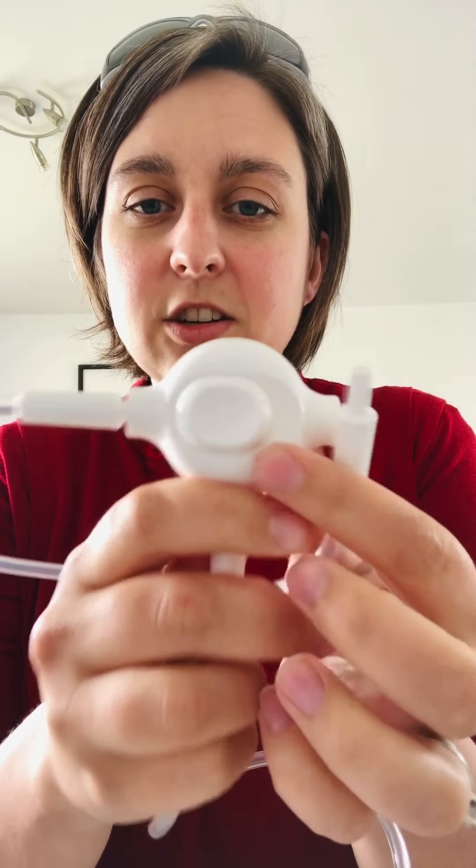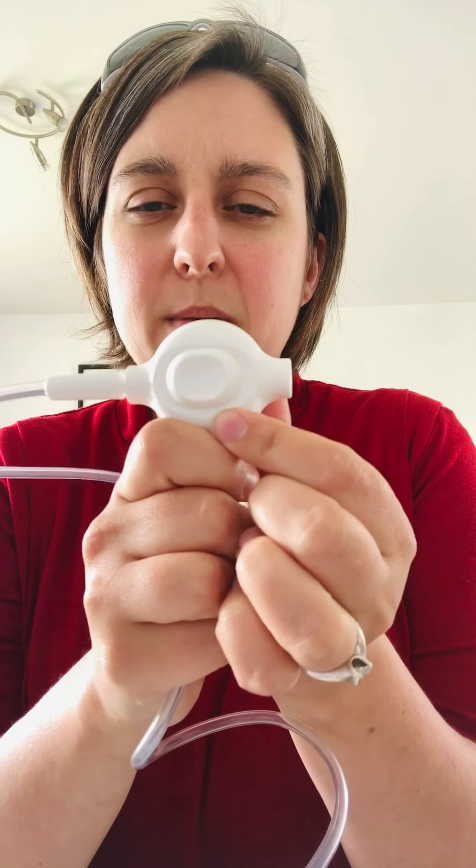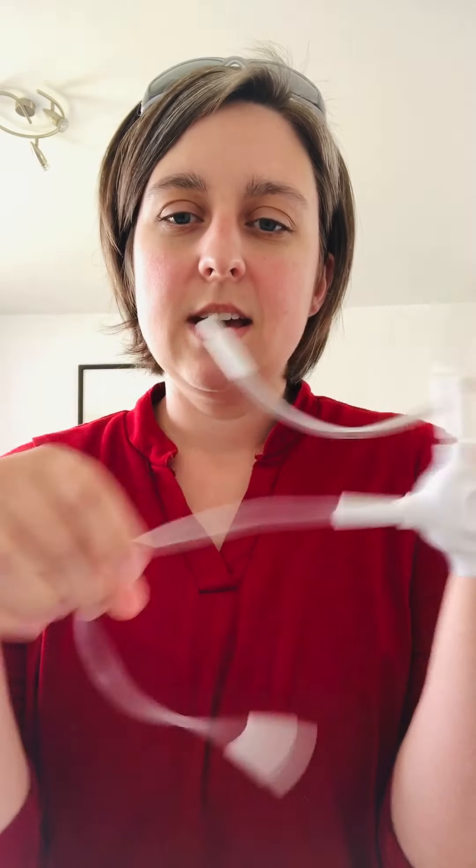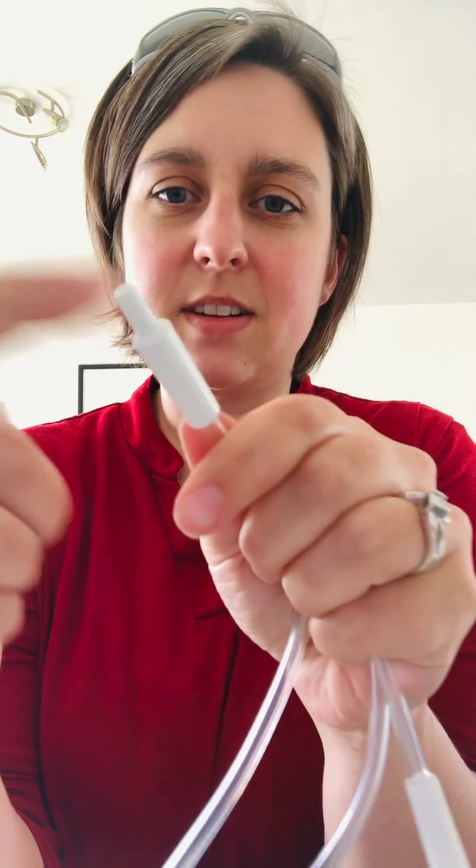This one has a little gauge on the back: if you want to double pump, you put it in the middle; if you want to pump just one side, you put it over there; if you want to skip that side, you put it on the other side. The tubing is really interchangeable.